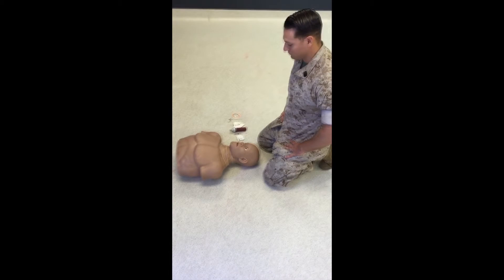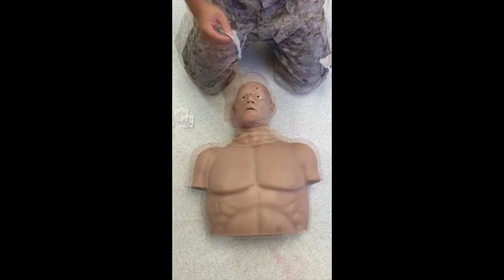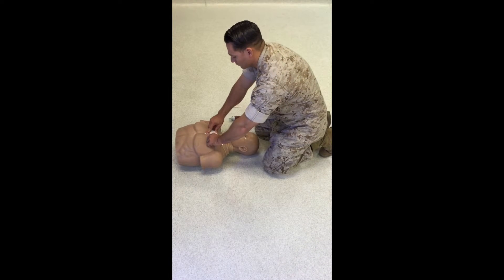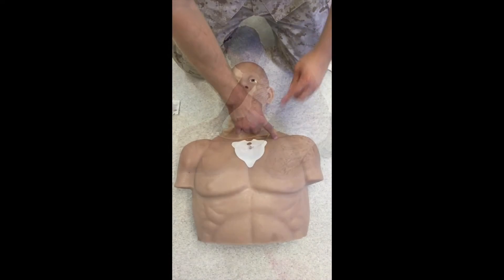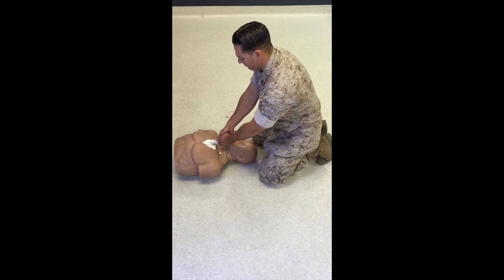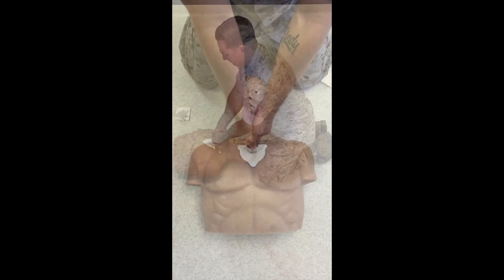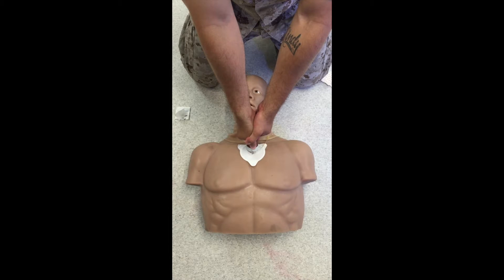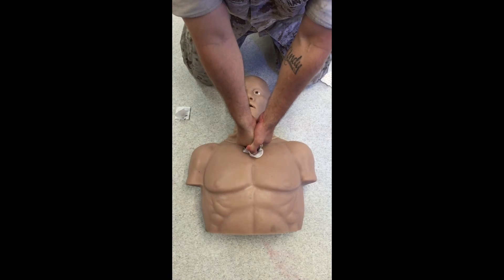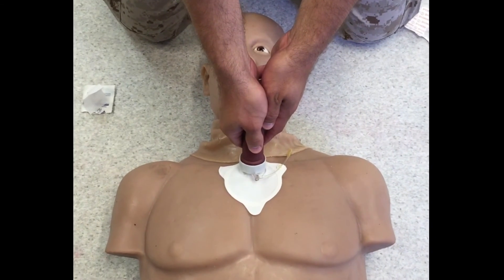Step 4: align finger with the jugular notch and place the patch, verifying the patch is midline. Step 5: place the introducer into the target area on the patch and hold with a firm grasp. Step 6: insert the introducer perpendicular to the manubrium, using continuous increasing pressure to insert.